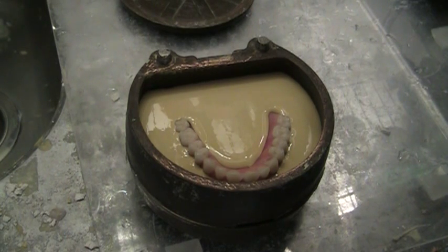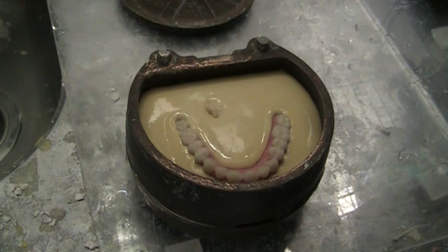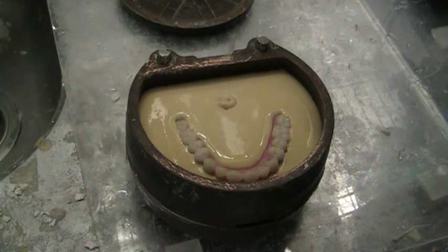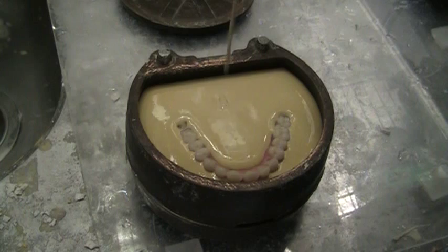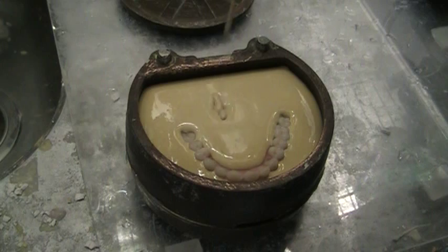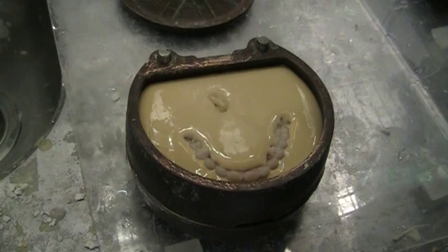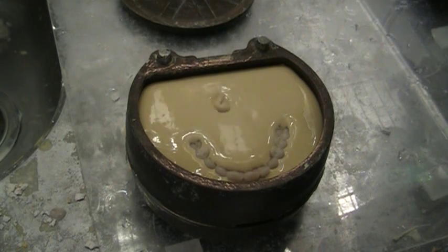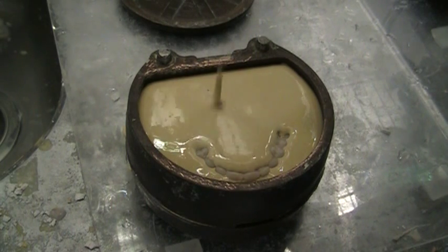The cool thing is in about 20 minutes this is ready to go, and it's much better than my 50-50 mix of hydro-cal and plaster that I was used to doing. I'm getting a much nicer result using this product rather than the old technique I used for years. I never thought I would change, but I gave it a whirl — first for the strength factor, second for the speed of set, and the lack of bubbles and vibration.